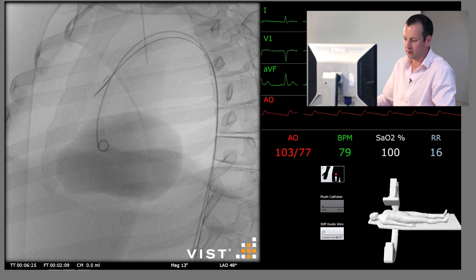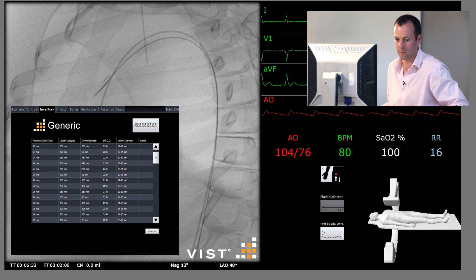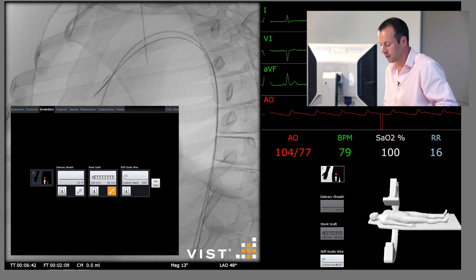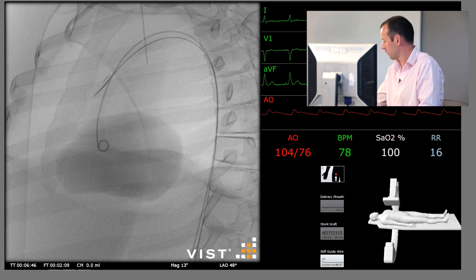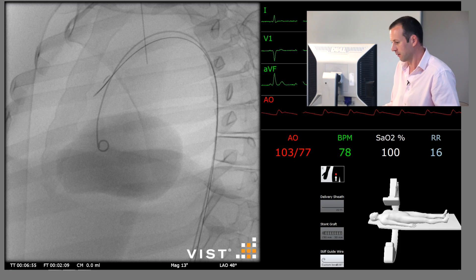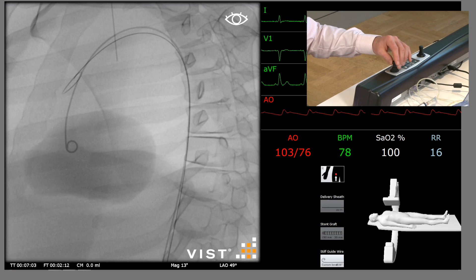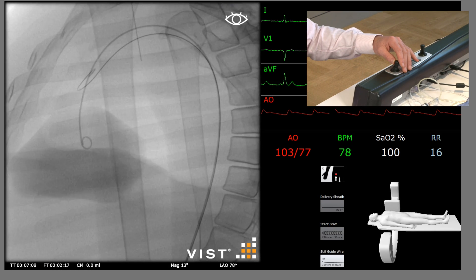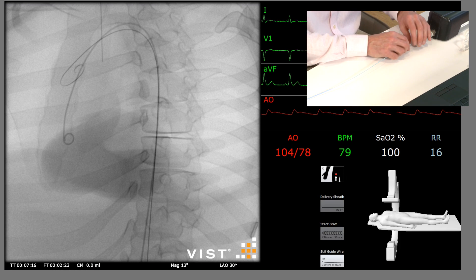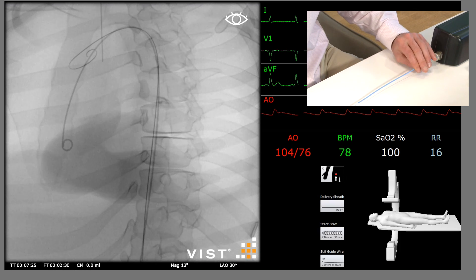Over this we're going to introduce the thoracic stent graft. From the CT measurements, we know that we need a 30 millimetre by 150 millimetre thoracic stent graft. This is introduced over the stiff guide wire — we don't need to do an angiogram yet. We can wait until we've got this thoracic stent graft in place. We're going to advance this over the stiff guide wire, aiming to keep the tip of the wire in roughly the same place. If it's allowed to move too much, there is a risk of causing dissection to the ascending thoracic aorta.